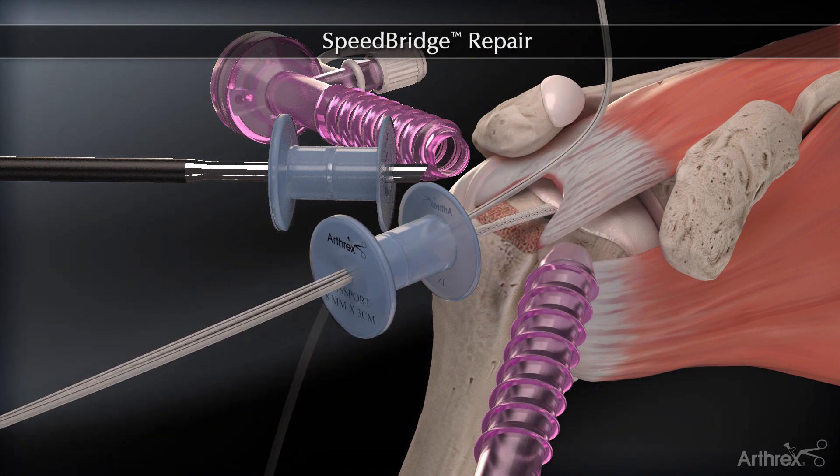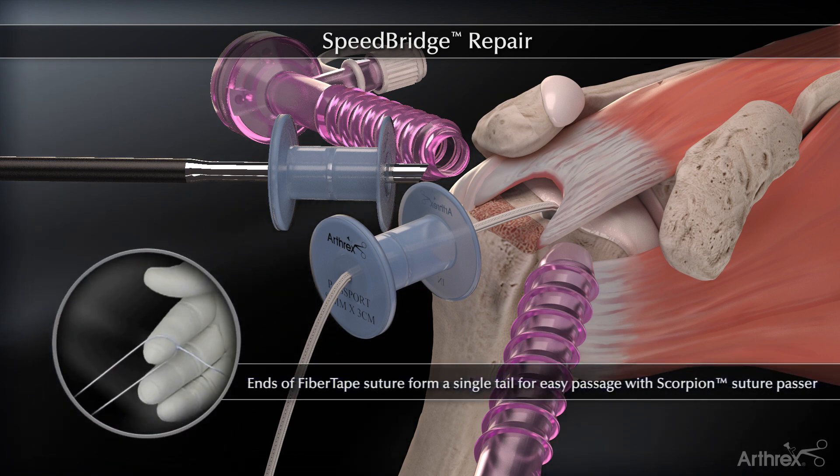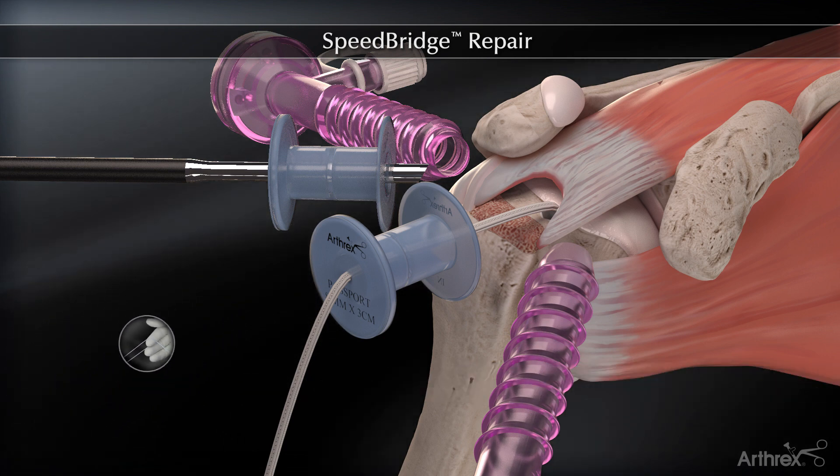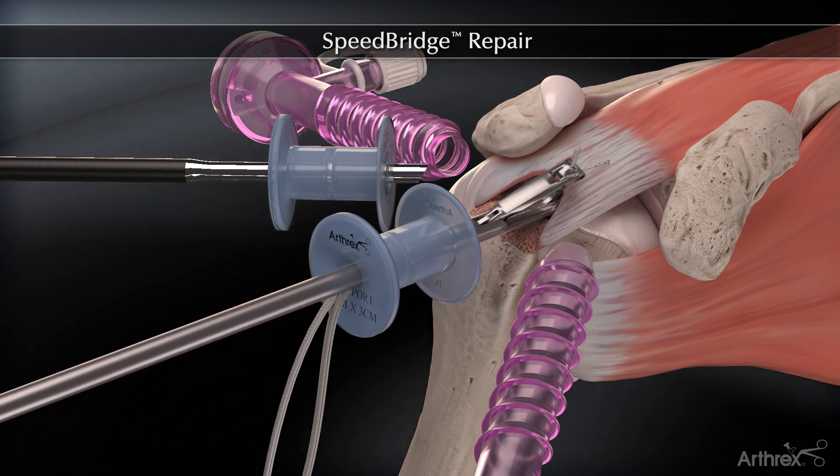The fiber tape is retrieved laterally. The fiber tape limbs are joined into a single tail to allow easy passage with a fast pass scorpion, which automatically retrieves the passed suture.